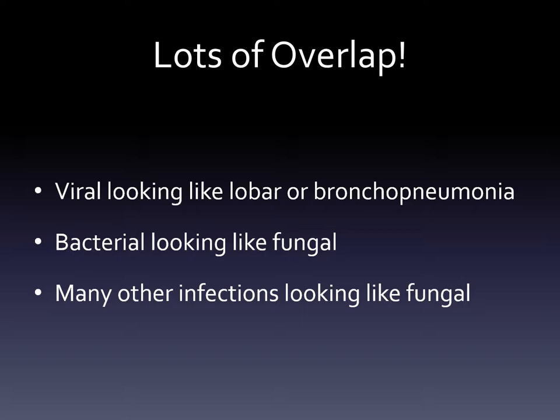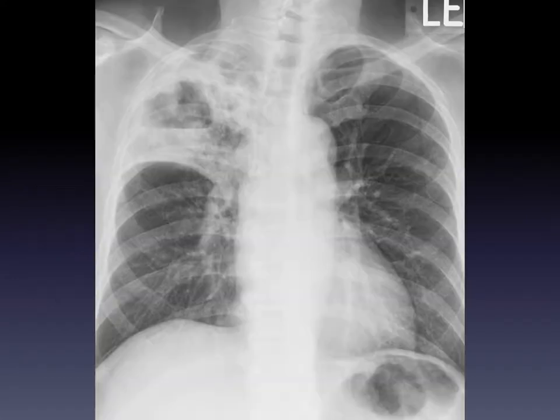I showed you some of the classic appearances of different types of infections, but it turns out there's lots of overlap — different types of infections might look the same, or one type of infection might have different appearances. For chest radiologists who look at these kinds of images every day, there are many different types of appearances. Here in the top part of the right lung, you see lots of whiteness — but do you see that almost circle-like shape? That's actually a cavity where an infection was so severe it destroyed part of the lung, and now there's an open space there.